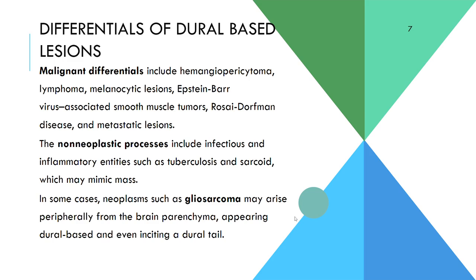This is a retrospective cross-sectional study that was conducted at a tertiary center. The inclusion criteria was extraaxial masses with broad-based dural attachment, giving a dural tail sign positive on post-contrast study. The exclusion criteria was extraaxial lesion with a known or a later diagnosed primary, and extraaxial lesion with leptomeningeal enhancement or with signs of infective etiology. The study was conducted using a 1.5 Tesla MRI, Philips and Siemens Magnetom scanners.